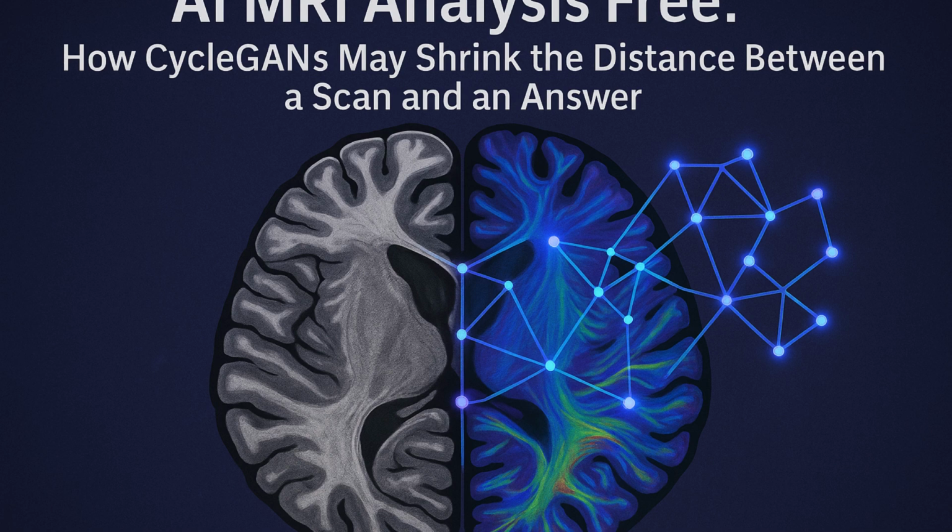That's a big one. Performance on internal data can be misleadingly high. And who decided when the AI was wrong? Was it an experienced radiologist checking the false positives, or someone less qualified? Good point. Adjudication matters. How are errors defined and counted? So yeah, AI MRI analysis free isn't a simple yes-no. It's more like a probability. It depends on technical factors, socioeconomic factors, a whole web of things. And if some random website asks for your credit card for a free diagnosis, run away. Pretty much. High-quality medical image analysis needs serious resources, serious expertise.